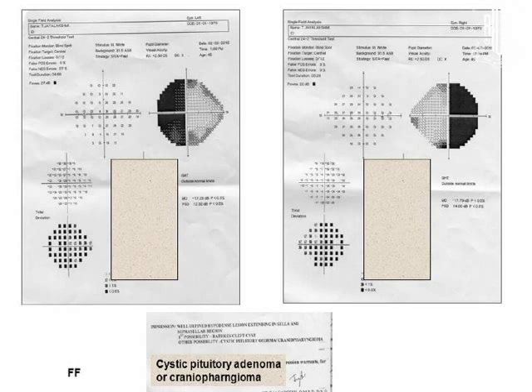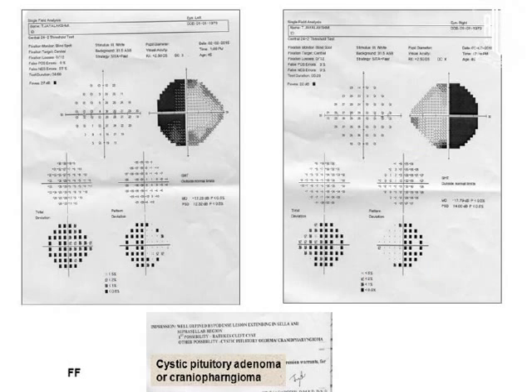It usually indicates a cataract; it can also have this. Now if this patient develops a neurological condition, a black square is always there, even if the sensitivity is increased by another 5 dB or 6 dB, the black square will not change. So in order to appreciate a localized scotoma in the generalized depression, the probability plots are created. Now we can appreciate the localized scotoma in a generalized depression, and you can appreciate it in the grayscale.